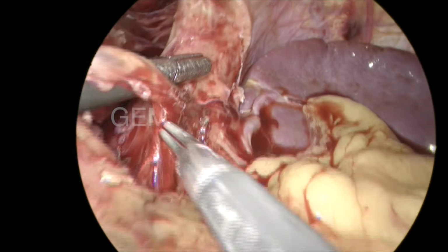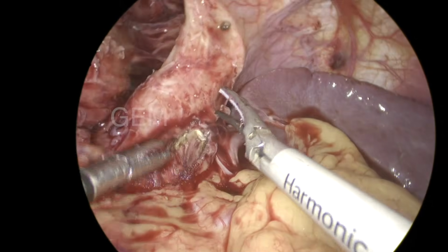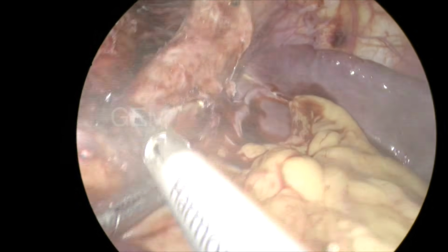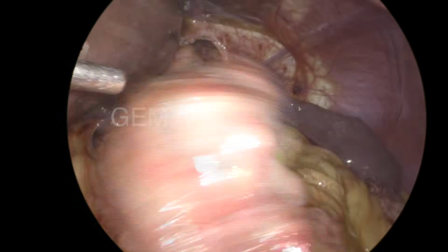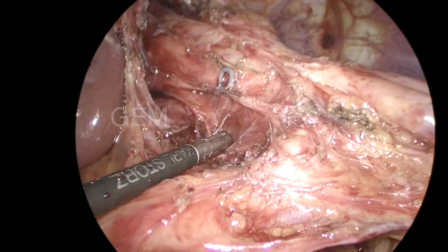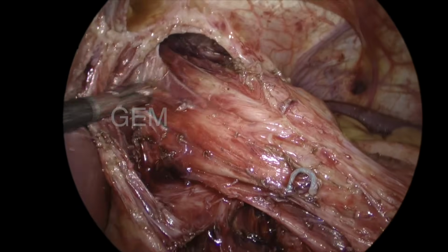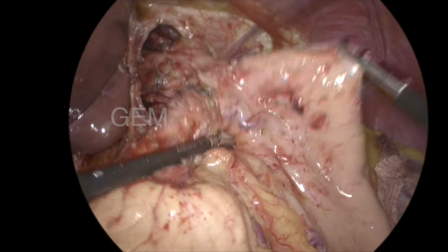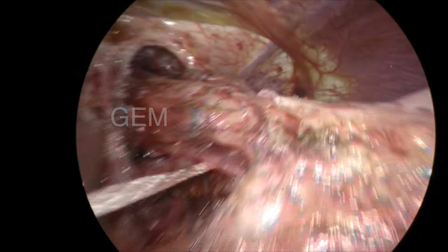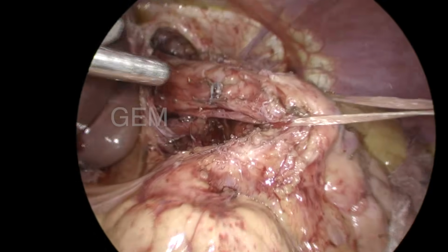That is called the posterior gastric artery. Again you can see, it is not inferior, it is from the splenic; the artery is coming from the splenic and going to the upper pole of the spleen. Can you see it is going to the upper pole of the spleen? That is the posterior gastric artery from the splenic artery. Now you can see the vagus, the full thick vagus, that is the anterior vagus, and that is the lymph node. Now I have to straighten the esophagus on the right side. The left side is already straightened by excising the sac, the area where the fundus had gone inside.